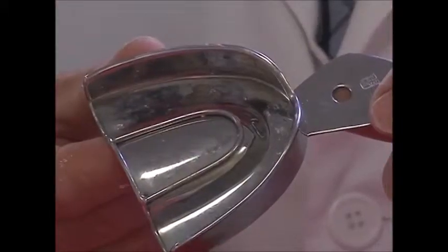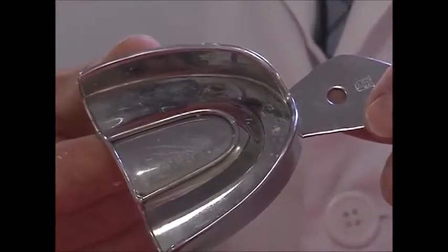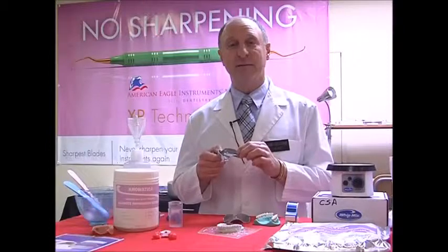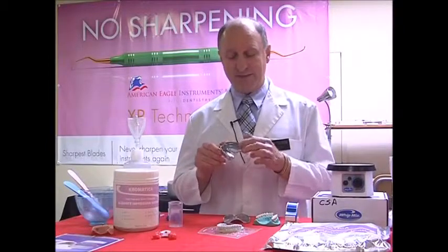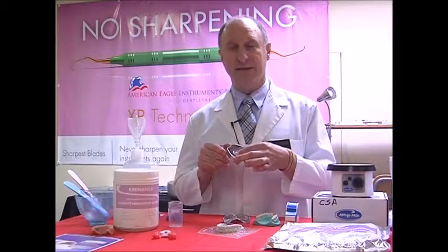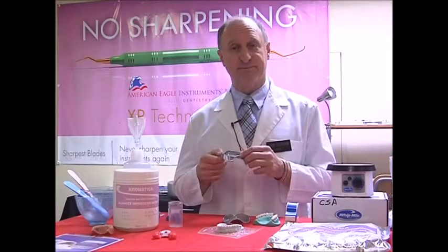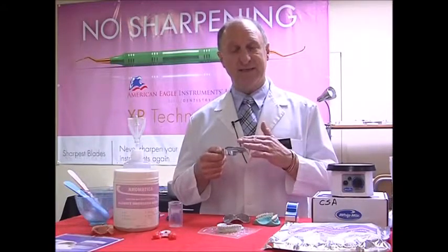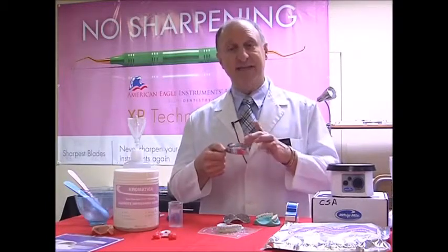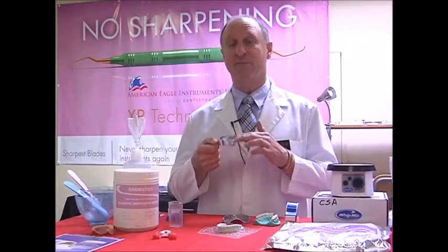The solid tray, which a lot of people don't like using because they thought it doesn't hold or adhere the impression material as well as the perforated tray. Actually, about 5 years ago, the manufacturers made the rims around and also internally thicker, so it actually gives as much, if not better, adhesion than the perforated tray. When we put the alginate inside the tray and compress it, it produces a much more compressive impression known as a muco-compressive impression.